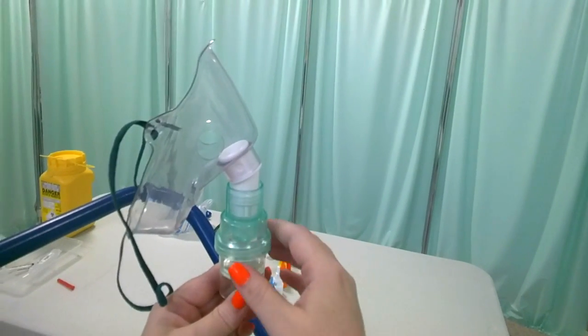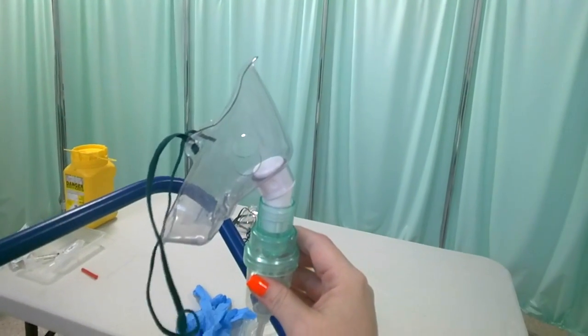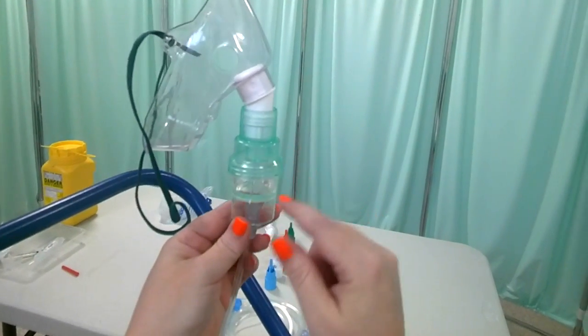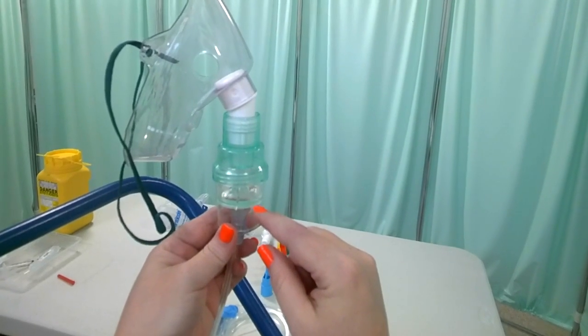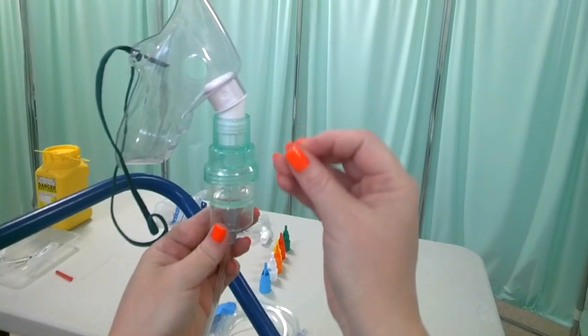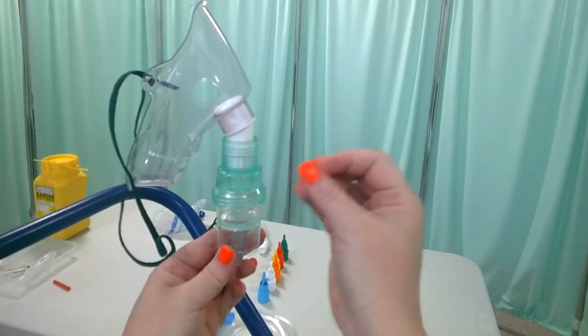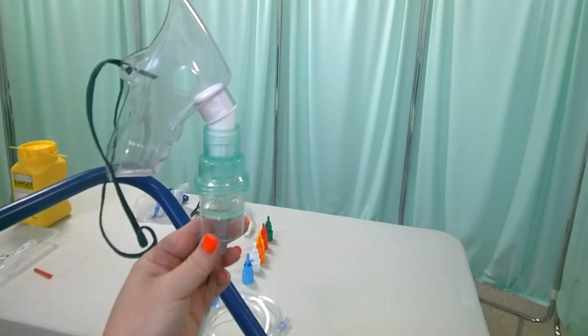The second thing that you'll notice is that there is now no longer any misting or any aerosolizing action happening through the mask. So basically what is happening is that all of that medication is staying in the nebulizer chamber, and the agitation provided by the flow rate of the gas passing through the chamber is not actually sufficient for it to aerosolize and exit the mask where it can be inhaled by the patient.